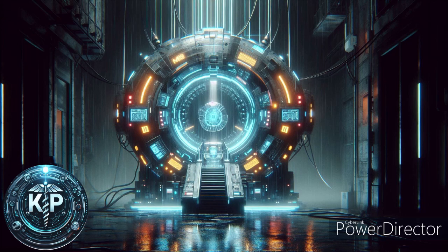Causes: coils within the MRI scanner may be damaged or worn out. Preventive measures: routine maintenance plans should include coil inspection and cleaning. If image quality deteriorates, experienced repair technicians can repair coils efficiently.